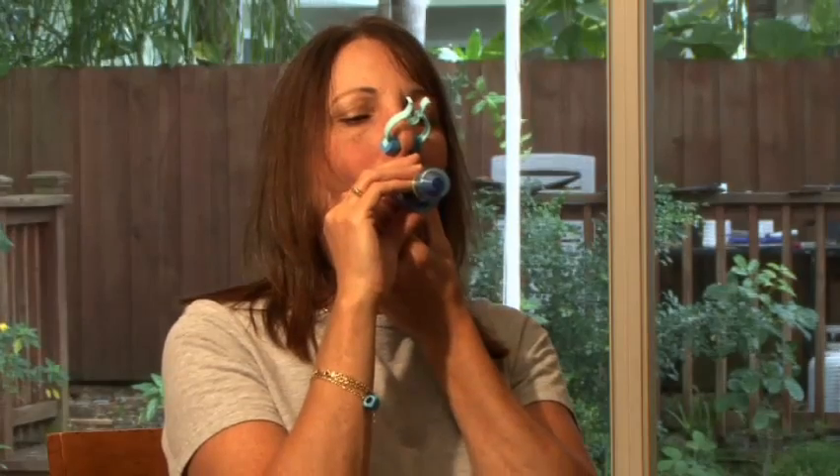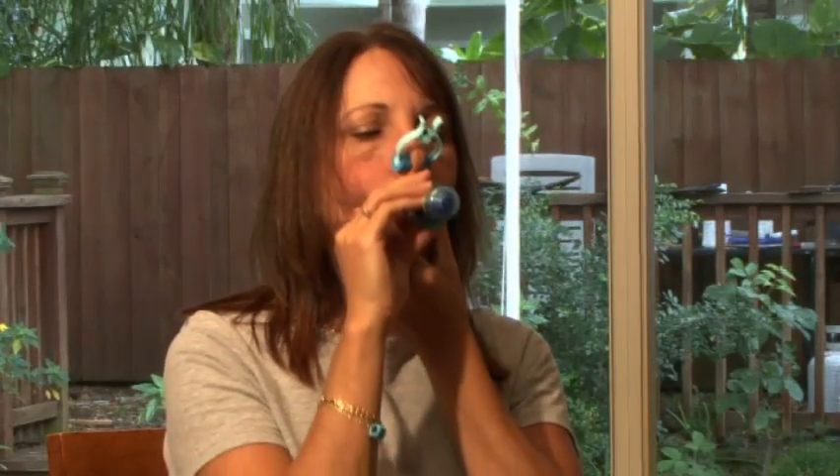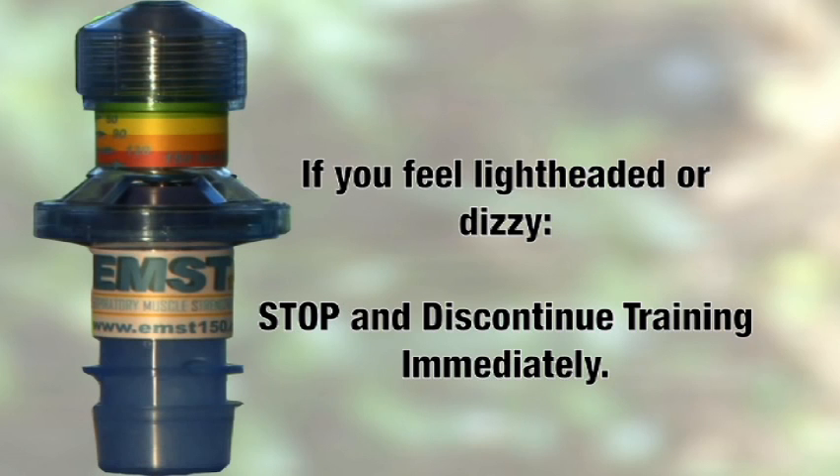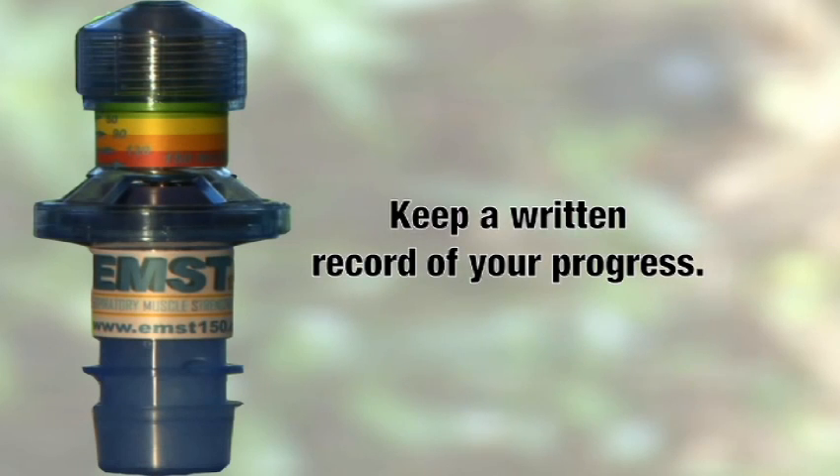Repeat this exercise 5 times, then take a minute break. We call this a 5-breath trial. After the 1-minute break, do another 5-breath trial, then take another 1-minute break. You need to do 5 five-breath trials for a total of 25 training breaths each day. If you feel light-headed at any time during the exercise, stop and discontinue. Record the date and time the exercises were completed.